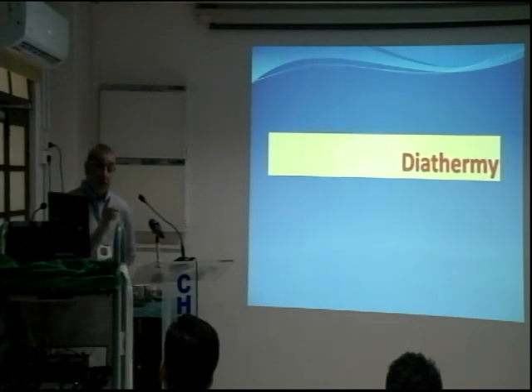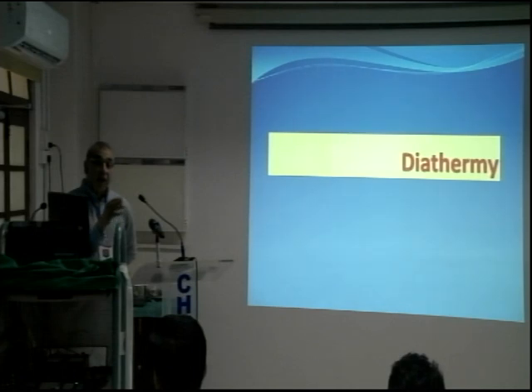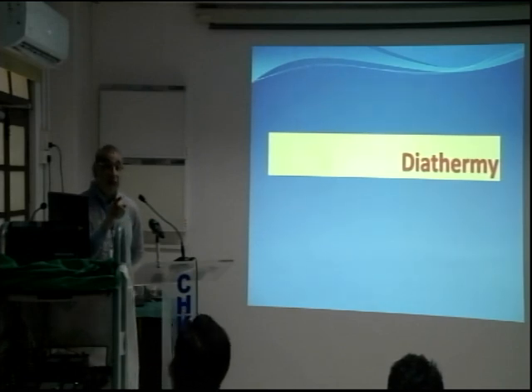Especially if you are doing a combined procedure, आप OGD पहले करें and if you follow it up with a colonoscopy, during OGD whatever air you put in tracks down to the colon, even past a small valve, and that can make it very uncomfortable for the patient if you are not conscious of that. तो अगर आपने combine करना हो तो make sure कि when you do OGD मिनिमल एयर डालें और मैक्सिमम उसको निकालें, लेकिन फिर भी काफ़ी चला जाता है. हाँ, तो ये भी केयरफुल.